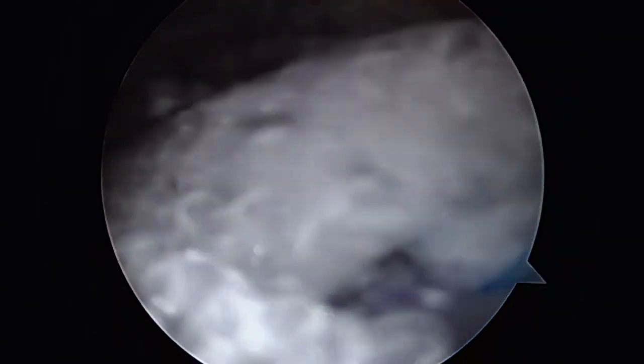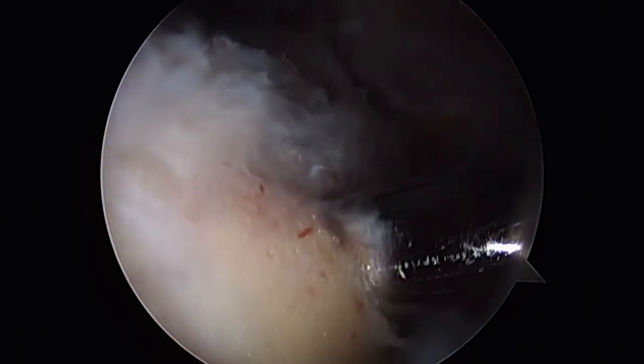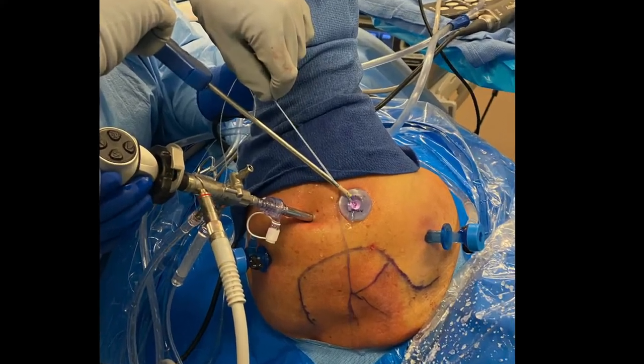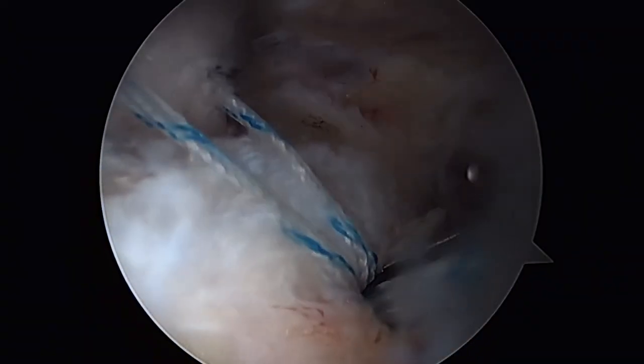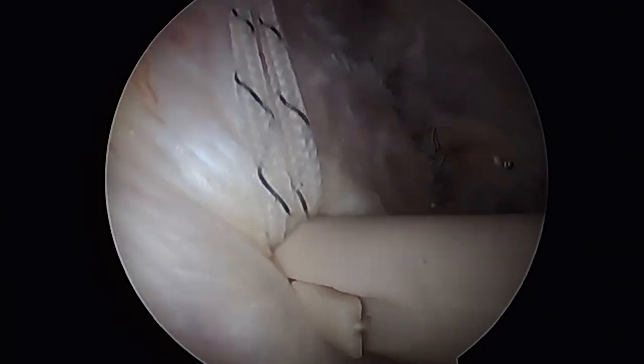We'll then gather the lateral sutures in the graft one at a time and place them into knotless suture anchors. As in a double row repair augmentation, the sutures in the lateral graft fix the graft to the bone, but can also be tensioned to load share and protect the cuff repair, taking advantage of the biomechanical strength of the BioBrace.